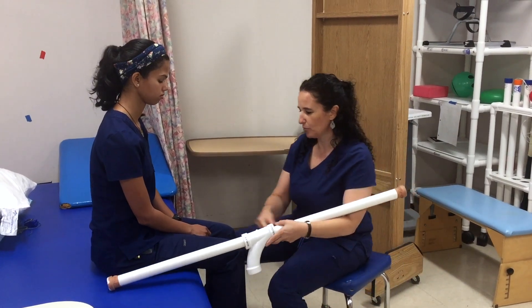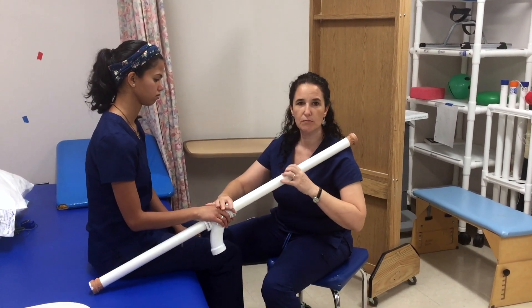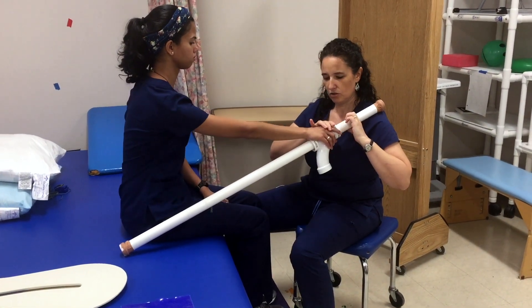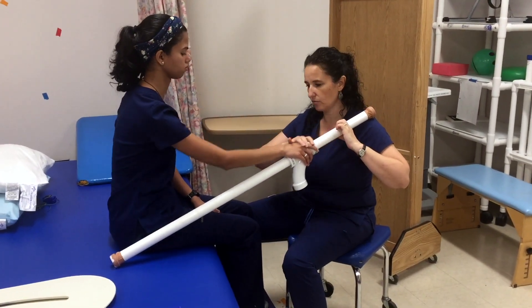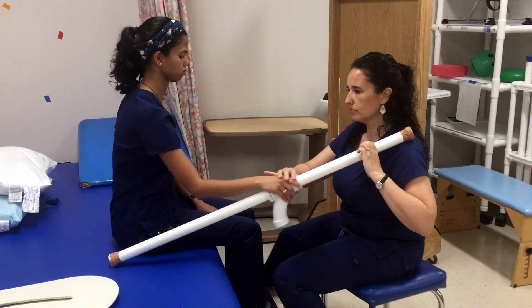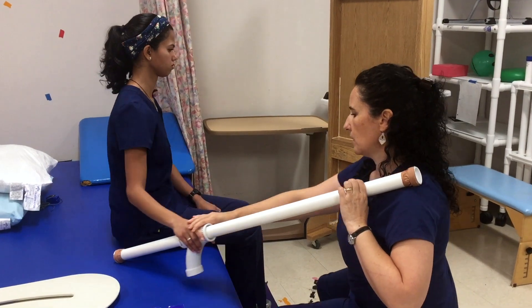So Jill, I'm going to help you with your hand here. Let's just do some shoulder flexion — just slide it up. You can use some Ace wrap if you need to, to hold the hand in place, or even do some hand over hand. The nice thing about it is you can move it at different angles if you're looking for a little bit more abduction or even some weight shifting.